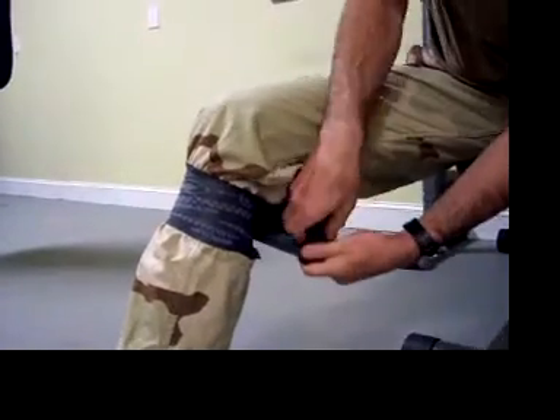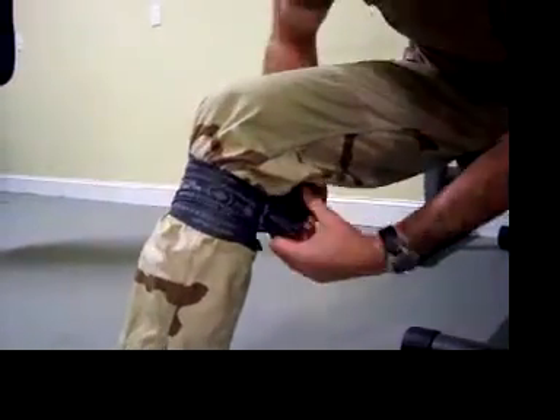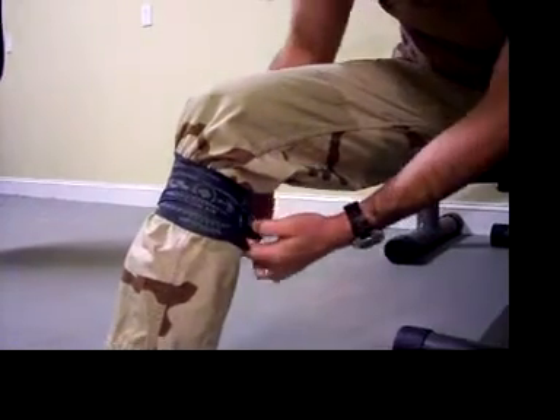The SWAT-T is very comfortable because of its wide base, and it is also able to be applied higher into the axilla and the groin.